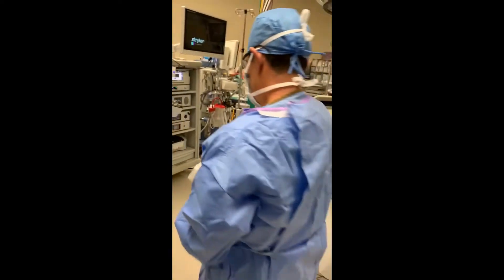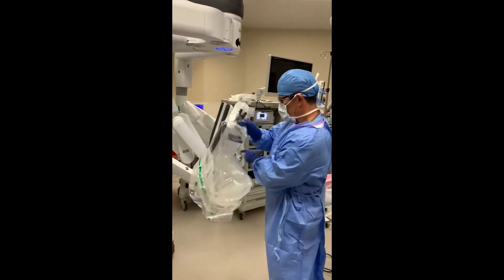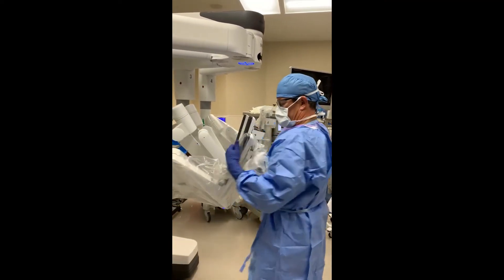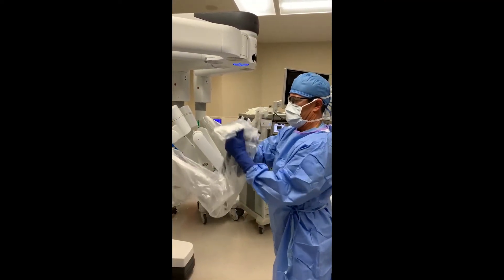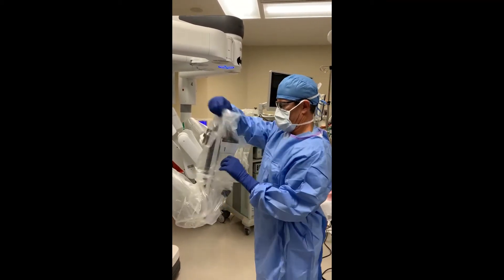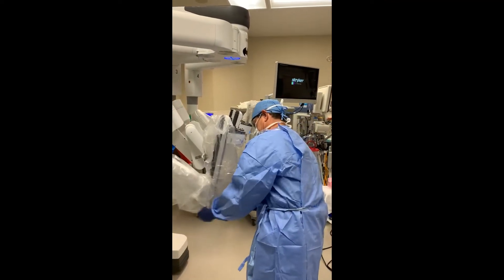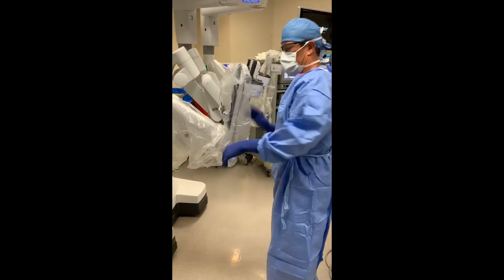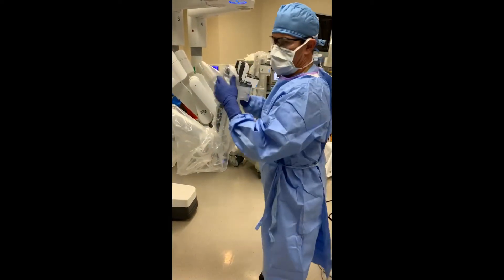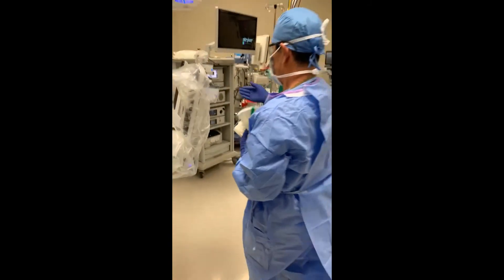Then I go to the other side. Again, this is a sterile technique thing — I'm not touching one next to the other. Feed it through, leave it there. There's the noise — that's locked on. Just keep progressing; it doesn't matter which one you go to now.